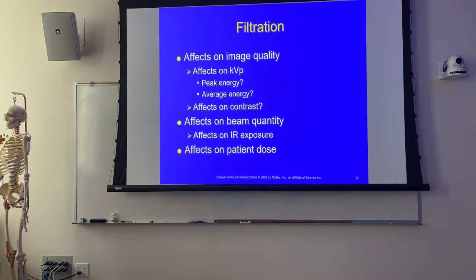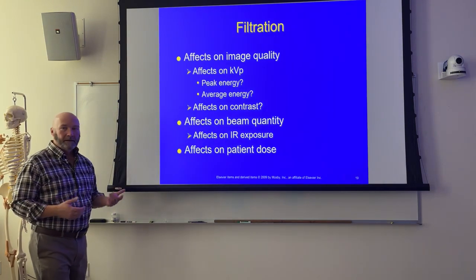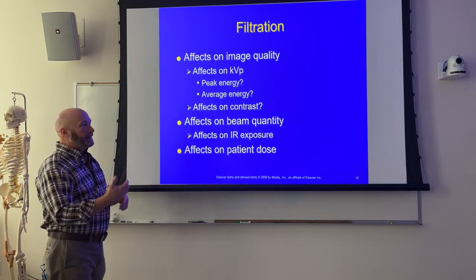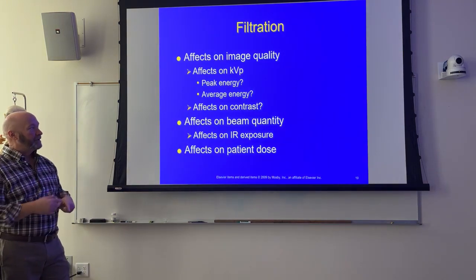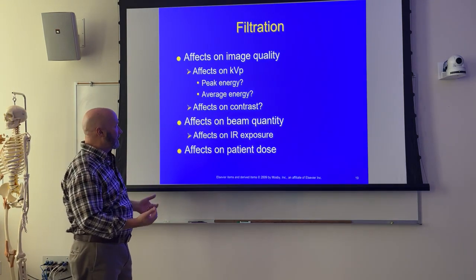All right, so effects on the image quality, really not. It doesn't really do anything to the image quality. The effects on kVp, none. It increases the average, but if we're talking about kVp peak energy, then it doesn't do anything to the peak energy. It does increase the average energy. Effects on contrast, really none. Again, because your computer algorithm takes care of all that.